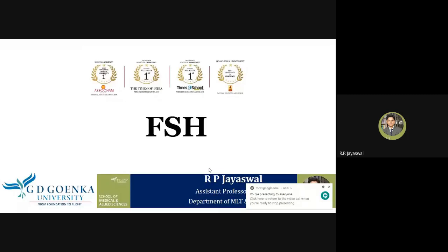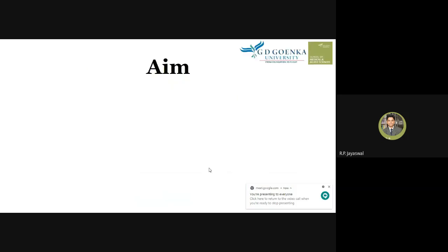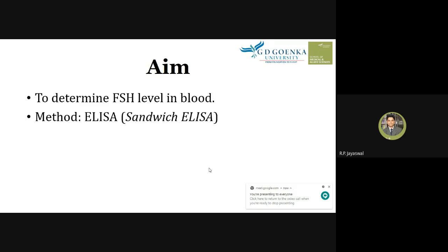So, good morning, students. We are going to study the FSH test, and in this test, the aim is to determine FSH level in blood. What does FSH stand for? The method we are going to use here is ELISA, that is sandwich ELISA.